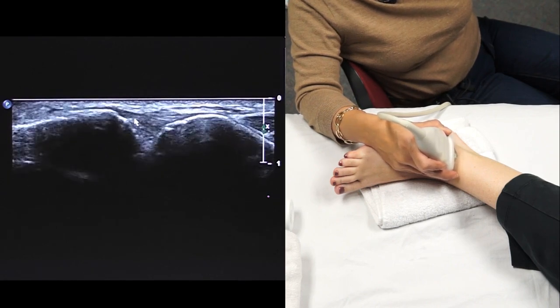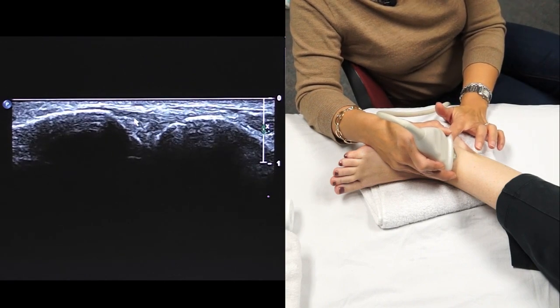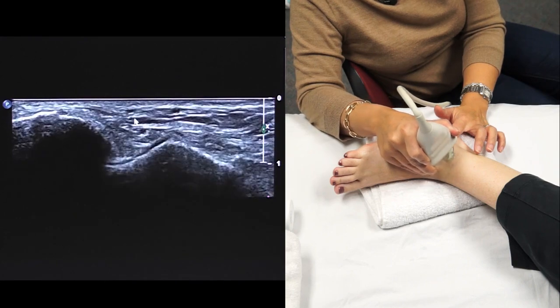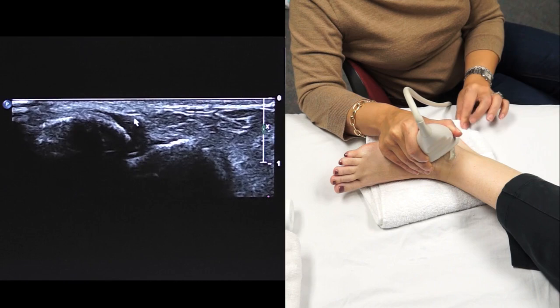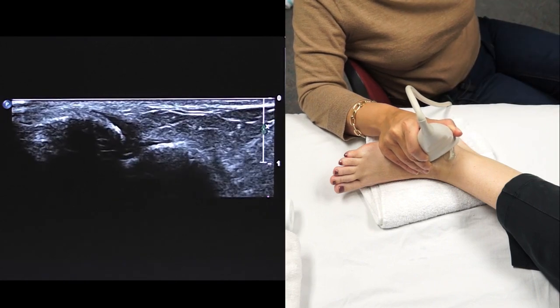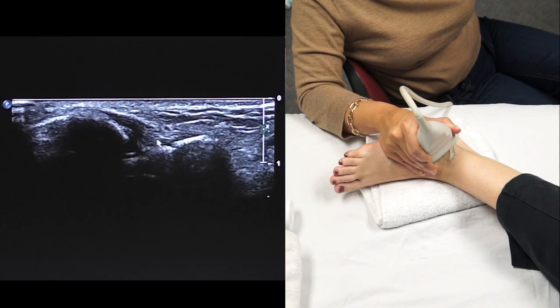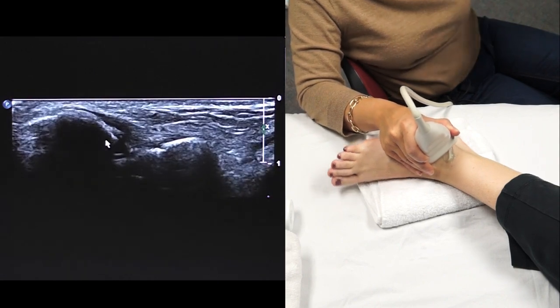Okay, now to look for the talofibular ligament, you keep your transducer on the lateral malleolus and you just swing it down towards the talus, and that's where you can bring the talofibular ligament into view. Now, one way to bring it out is to have the patient plantar flex or point down.